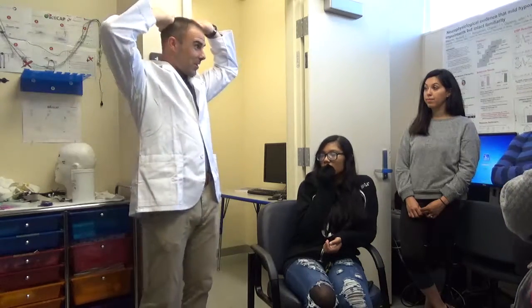So, we'll explain that. We'll hold that. Thank you, Jose. And the other thing that we'll then explain is that what we also do is we record the brain activity, but what ends up happening is because this is electrical activity, that's used to basically signal between neurons, but also between neurons that communicate with anytime you have a muscle tension. So anytime a muscle squeezes, it's going to send a huge jolt of electricity that's going to interfere with our brain signals that we're trying to record. Now, one of those big muscle squeezes that happens all the time is when we blink. So every time we blink, boom, it sends a huge jolt of electricity across our scalp that's recorded in all of our other brain sites.